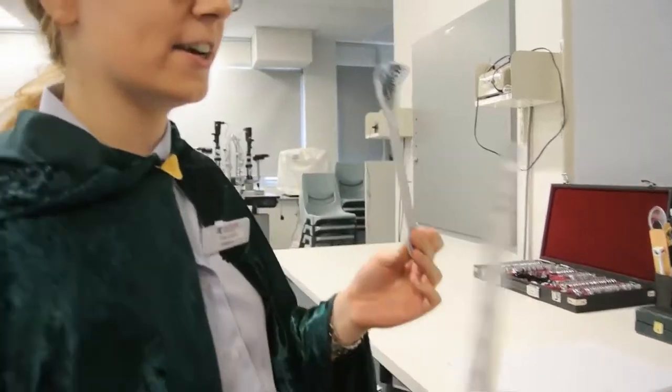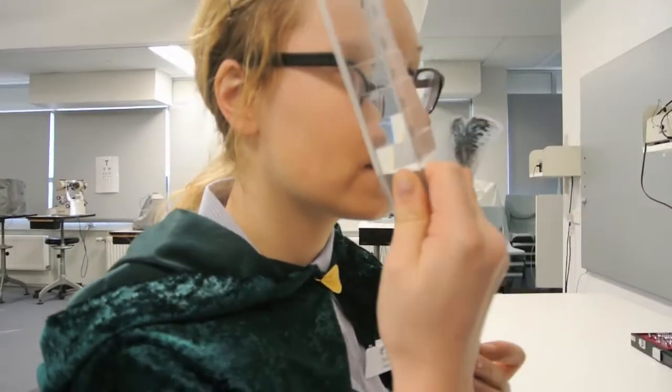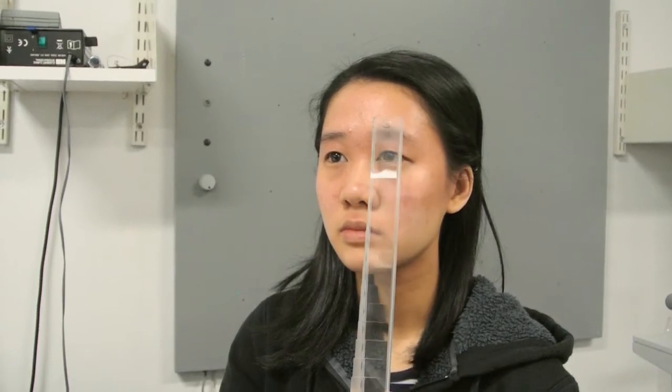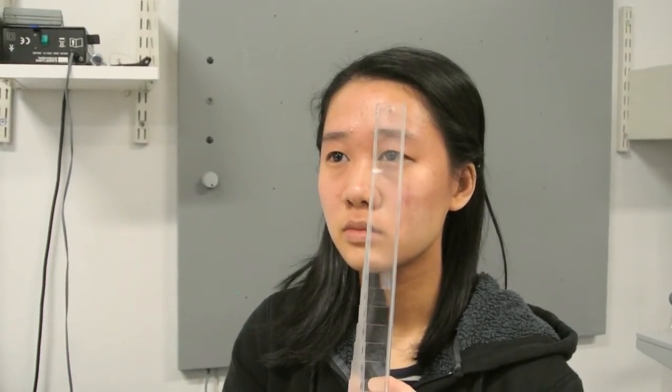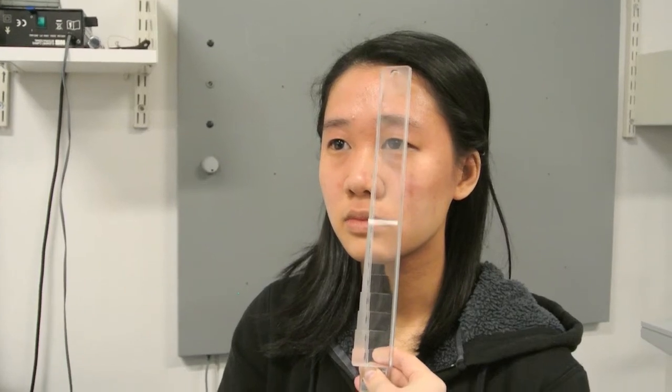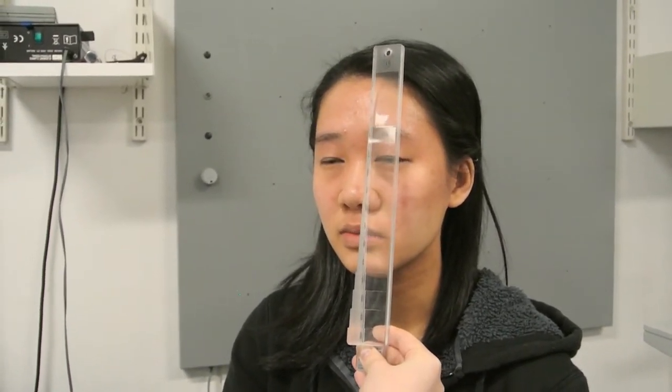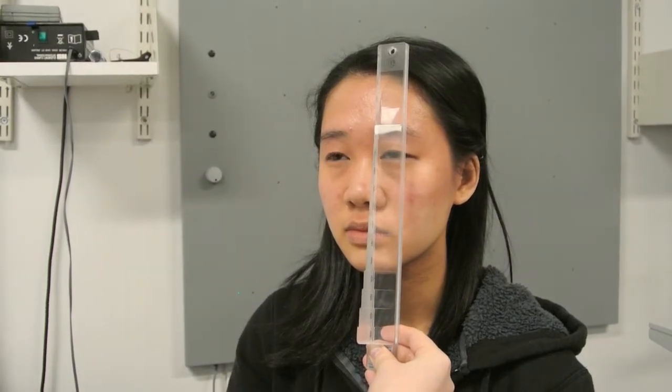So what I'd like you to do is focus on the beak of the three-eyed raven for me the whole time. I'm just going to put this prism bar in front of your left eye and tell me when the beak becomes double. Is it single? Just keep it single. It's blurry now. Blur is fine, just as long as it's single.